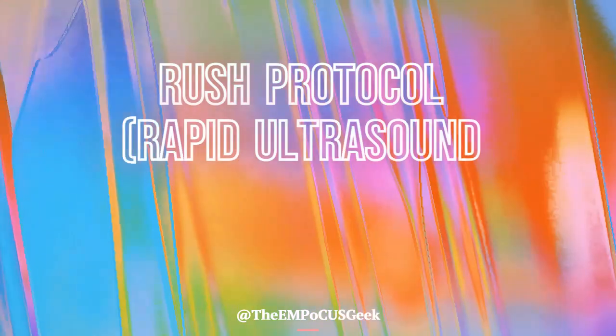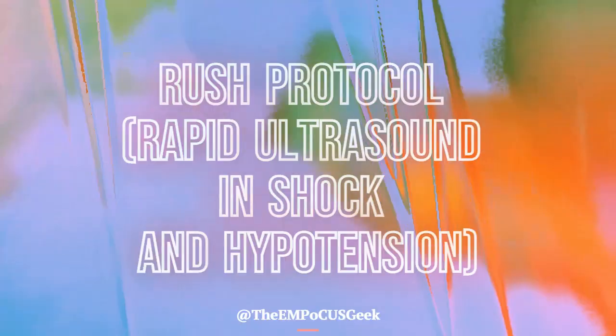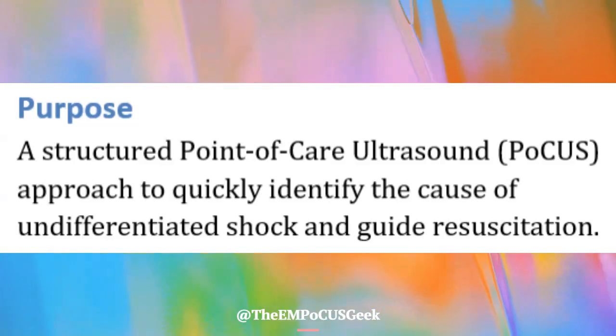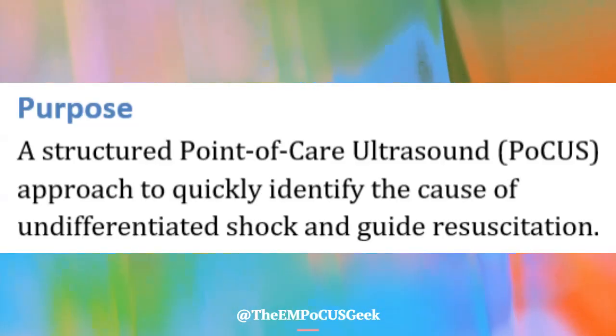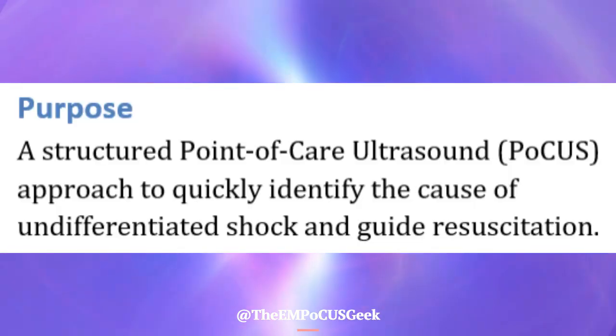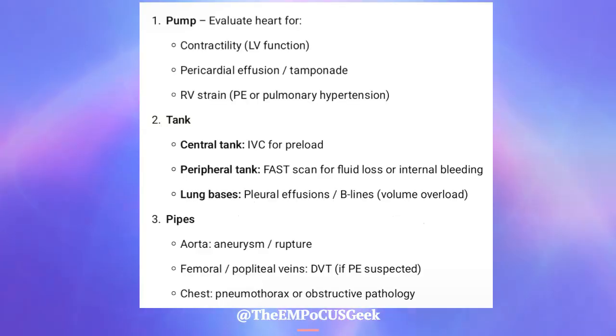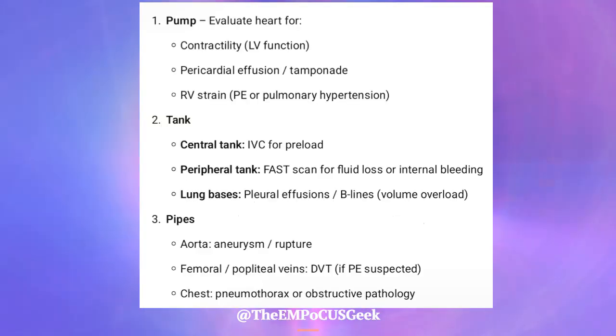RUSH protocol, rapid ultrasound in shock and hypotension. The RUSH protocol is a structured point of care ultrasound approach to quickly identify the cause of undifferentiated shock and guide resuscitation. In the RUSH protocol, we evaluate the pump, tank, and pipes.